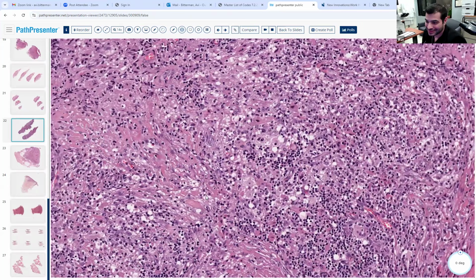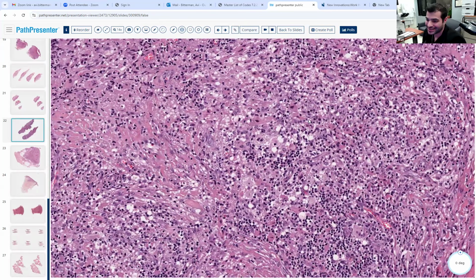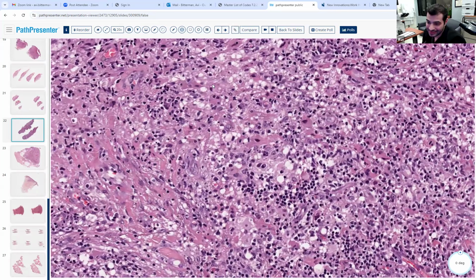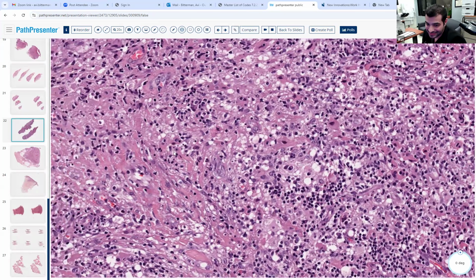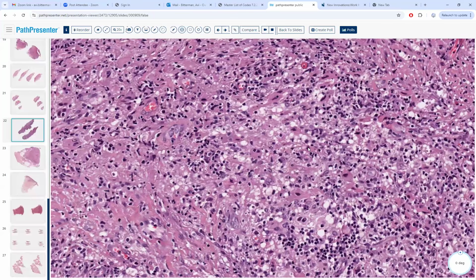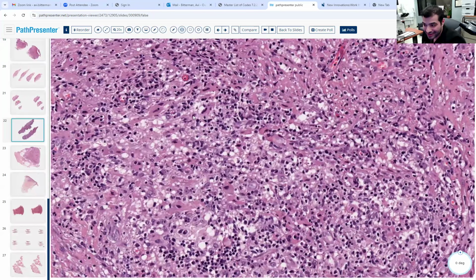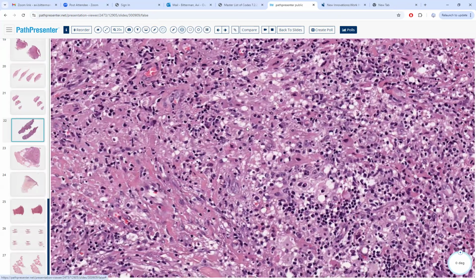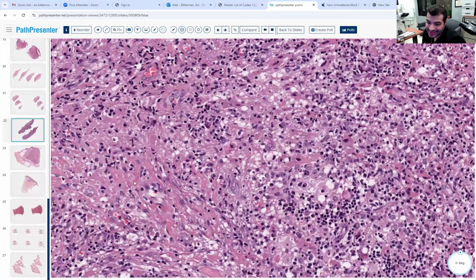So we have the white areas because there's probably what kind of cell in here? The clear areas with a lot of cytoplasm. Not necessarily fat. Some of them might be foamy, but not really. Histiocytes. There's a lot of histiocytes, and in this case they're almost pseudosyncytial.